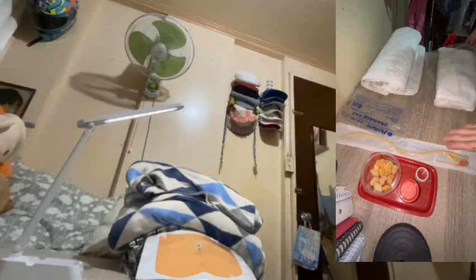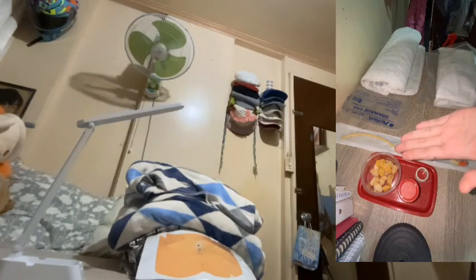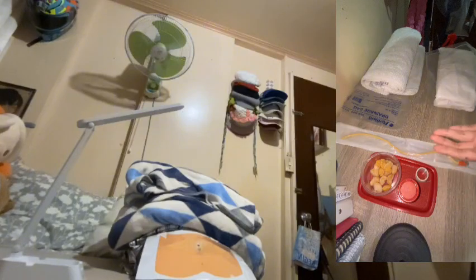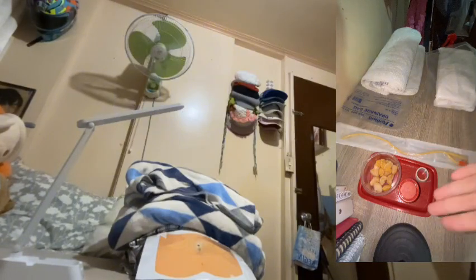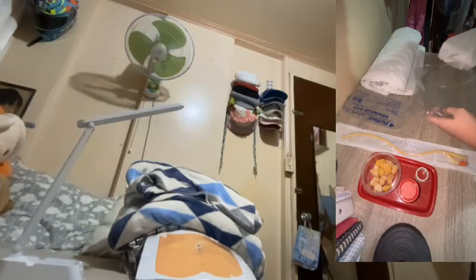So I have prepared also the necessary materials. We have here the two-way catheter, the drainage bag, the cleansing solution, cotton balls that are soap, a sterile urine container, a tape, and the catheter set.